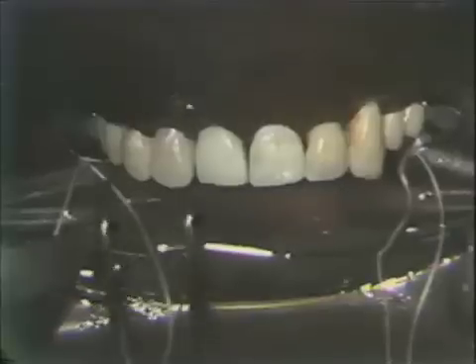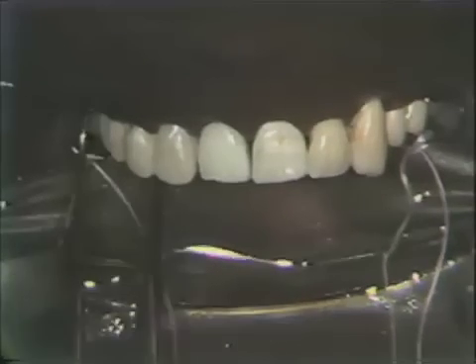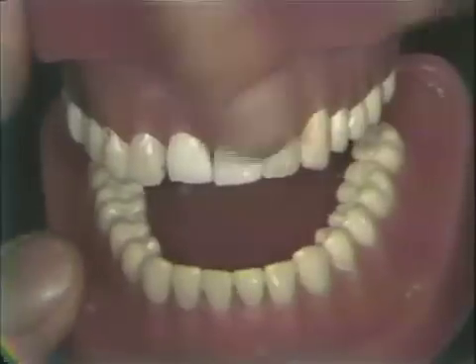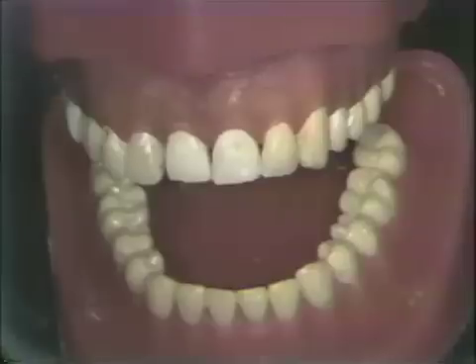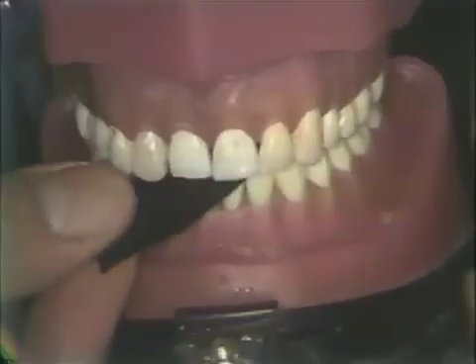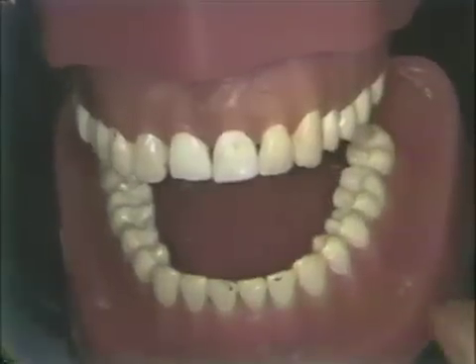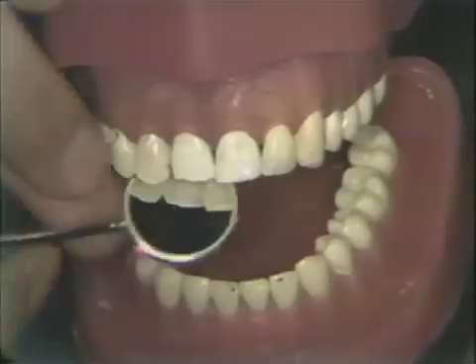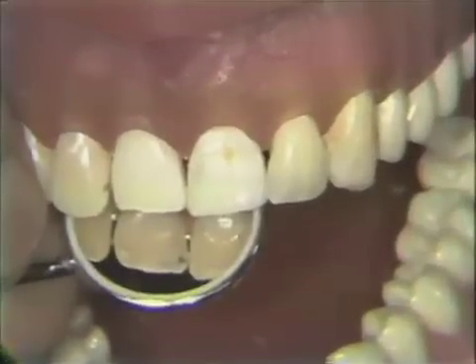And that we are now ready to remove the rubber dam, because we still have to check occlusion and have the patient feel the restoration with their tongue. With the rubber dam removed, before we put carbon paper or anything, put your finger on the tooth you've been working on and have the patient close. You can sometimes feel a jar or not. This is a good indication. Then the final check with the articulating paper, and as you notice the lowers, you can see 2 or 3 places it's marked. Now look back into the mirror, and you will see that we have the contact incisal to the restoration where it was in the beginning.